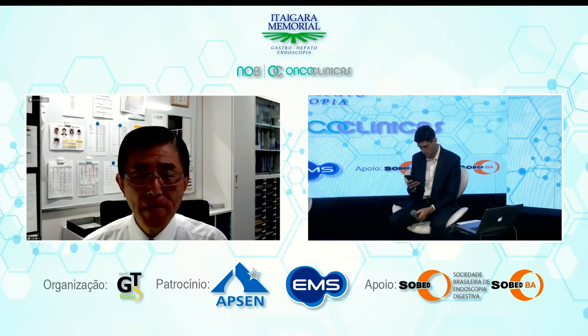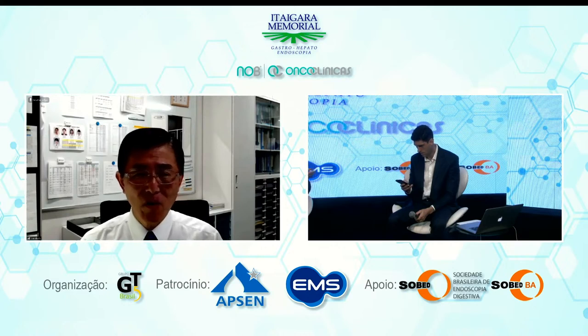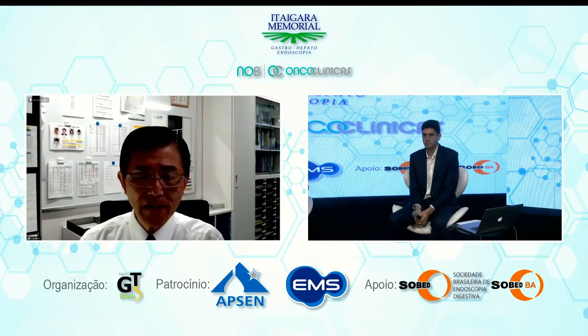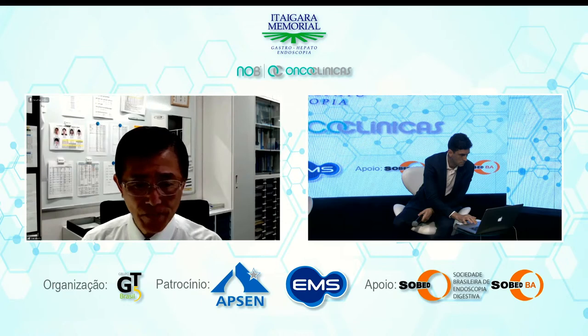Nowadays, magnification is essential for colorectal colonoscopic examination because without a chromo agent such as indigo carmine, we can easily distinguish between non-neoplasia and adenoma, and benign adenoma and carcinoma.